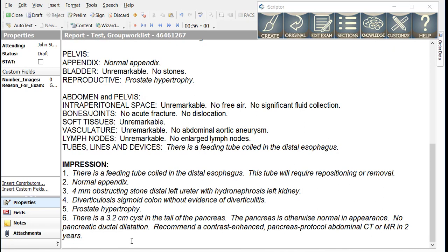Notice that even though the dictated text regarding a malpositioned feeding tube was at the end of the report, that finding is moved to the top of the impression. R-Scripter will automatically order the impression according to the most acute findings first. We had a normal appendix which was answering a clinical question and therefore that finding is also moved to the top of the impression.